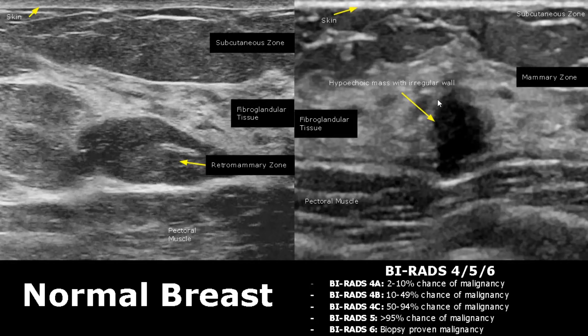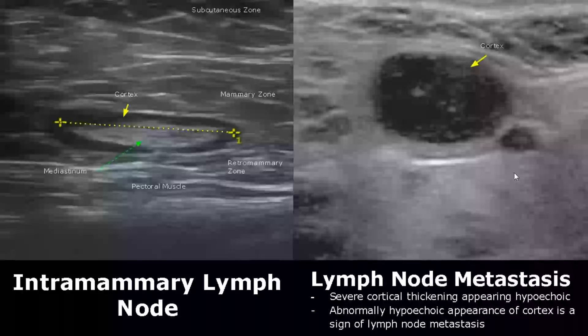Usually hypoechoic masses with irregular walls or a spiculated appearance are malignant, and they have a taller-than-wide orientation. Here we have a case of lymph node metastasis.